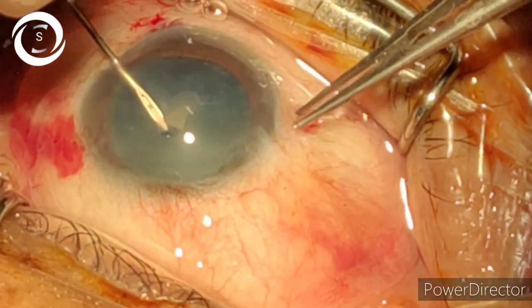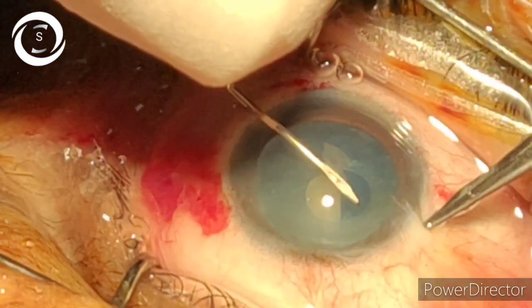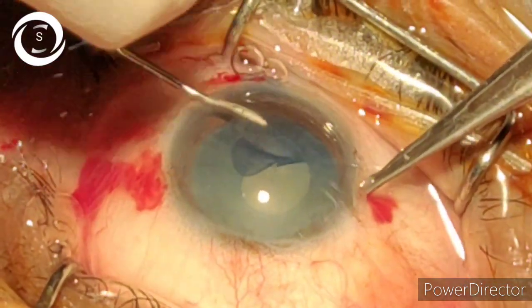I have been using this technique for the last four to five years, and with this technique the chances of posterior capsular rent are almost non-existent — almost 100% eliminated.